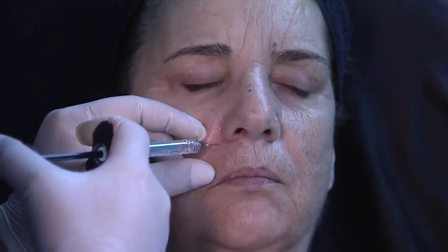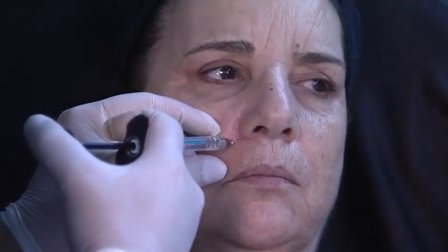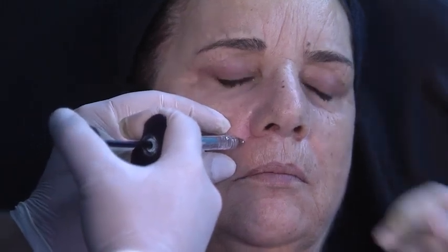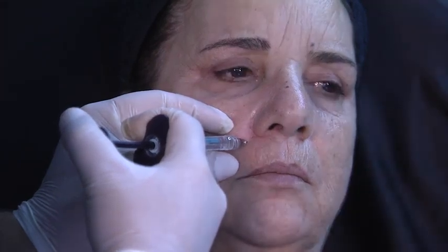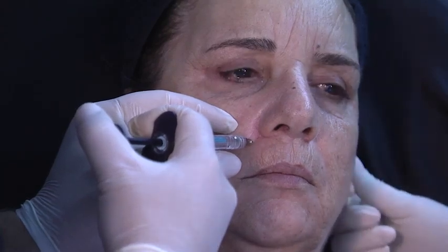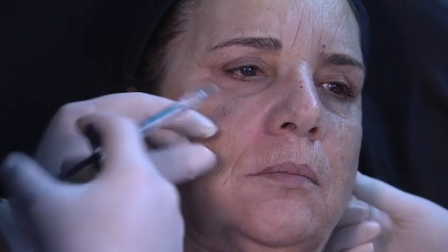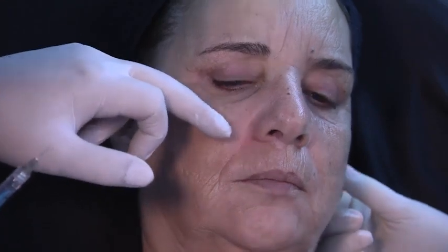So if I go completely perpendicular to the piriform fossa and I'm going to touch the bone. Look, all my needle is in. So if I am unlucky and we have an anatomical variation and artery could be there, I will be safe because I will go through it and I'm on bone. Relax. Okay, 0.3 to restore that volume, that's it. And now I can do the rest of the nasolabial fold.